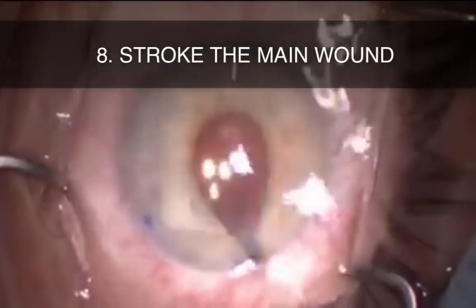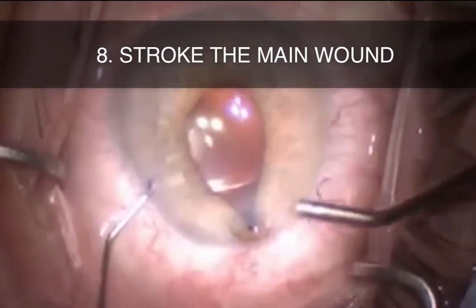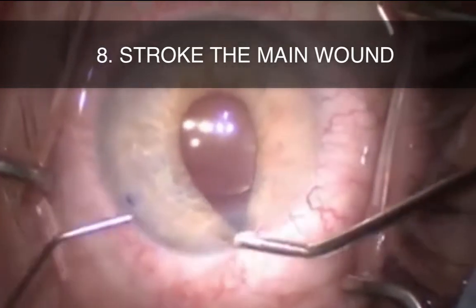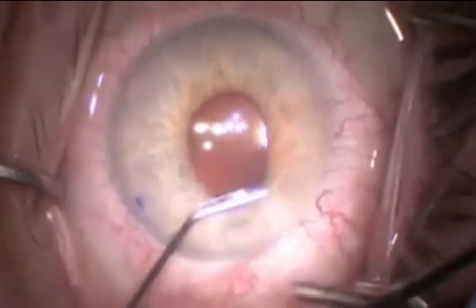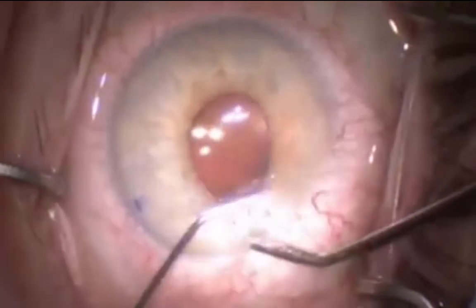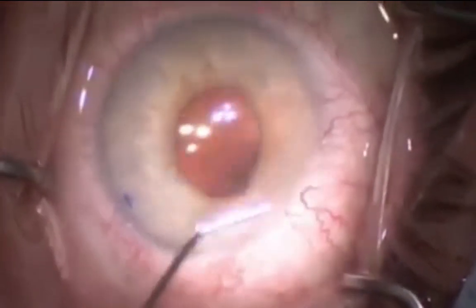Here you can see a case of prolapse during irrigation aspiration. The first move is to decompress the anterior chamber from the paracentesis, as we've mentioned multiple times before. Tip number eight, which you can see here, is to gently stroke the main wound with a cannula. This helps the iris to be released back into the eye.